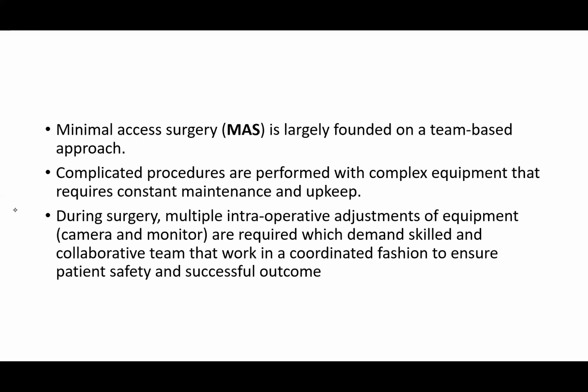Now, minimal access surgery is largely founded on a team-based approach. You see, this procedure is not a one-man show. You cannot be a surgeon, be a peri-operative nurse, be a biomedical engineer at the same time and be the assistant.